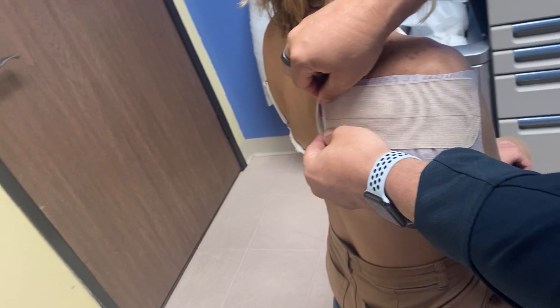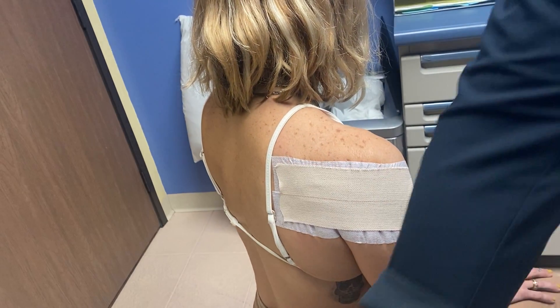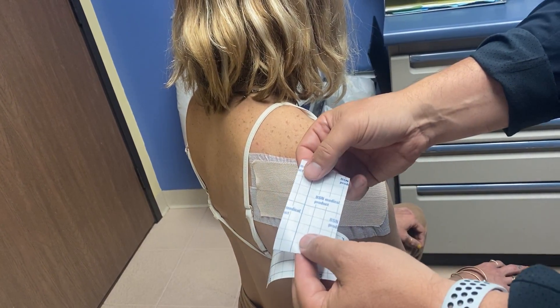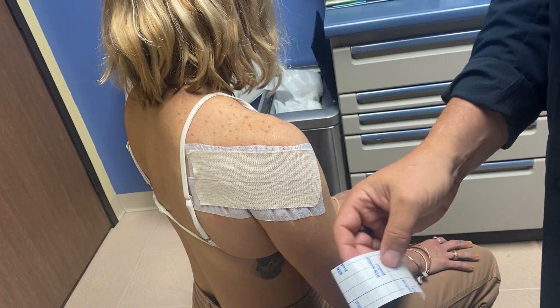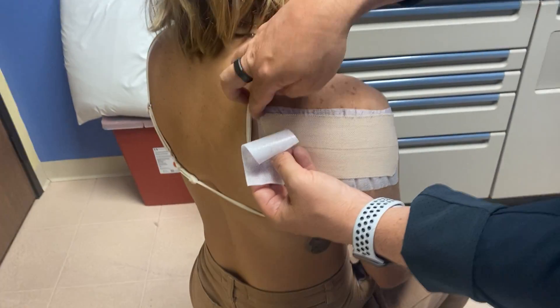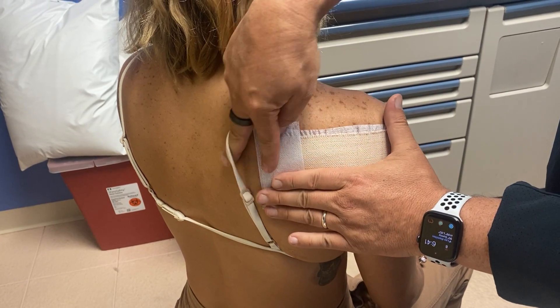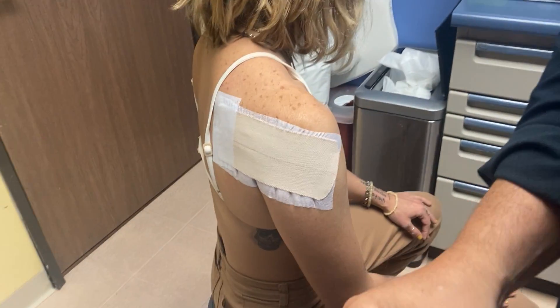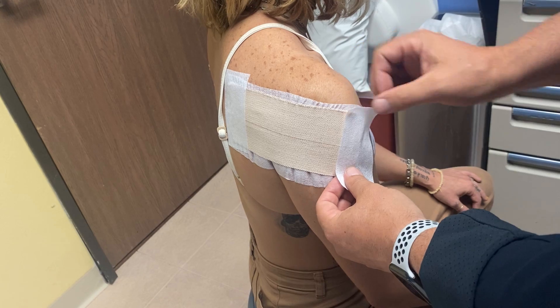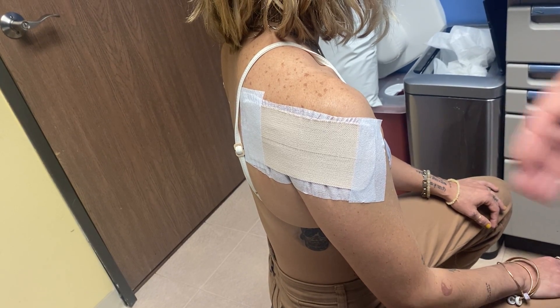You can get those Westcott non-stick scissors usually from Staples or other places online. Then we have our two-square, four-inch Cover Roll Stretch. We're just going to cover both ends to make sure that tape doesn't come off. There's quite a bit of stretch on that elastic — we want to keep making sure it stays in place. Unlike Kinesio tape, which has a mild stretch, this elastic we're putting a significant stretch on it, maybe like 80% of what it could stretch. That's the end of the glenohumeral tape.